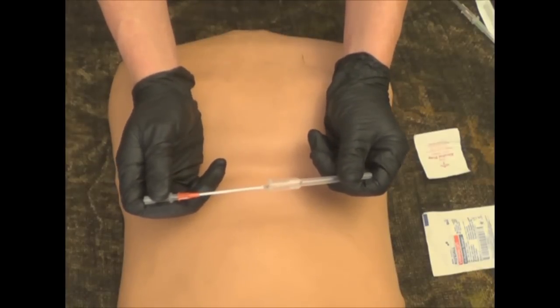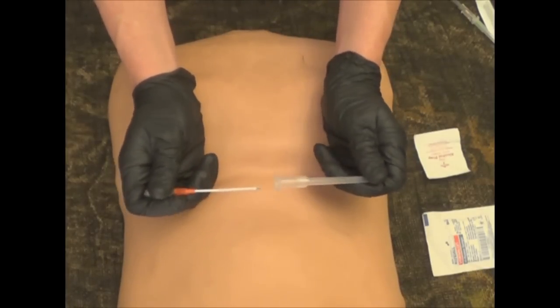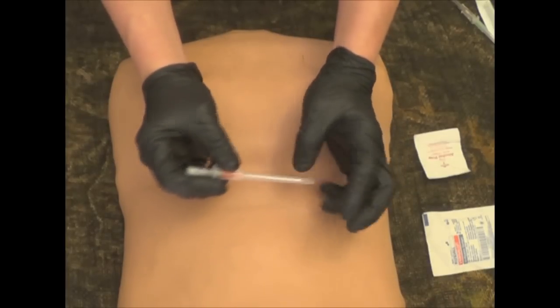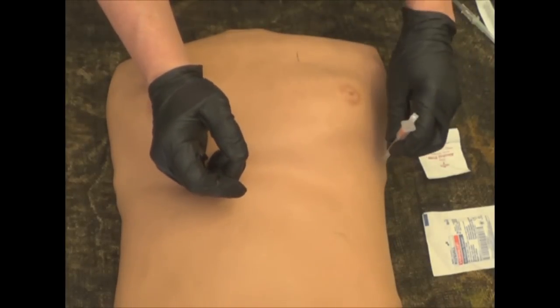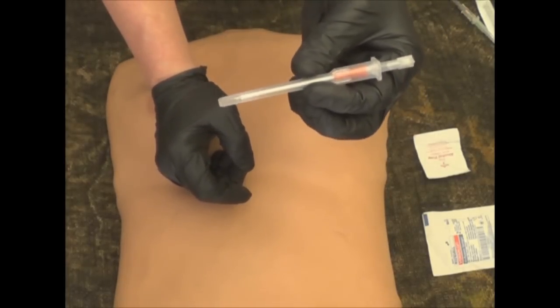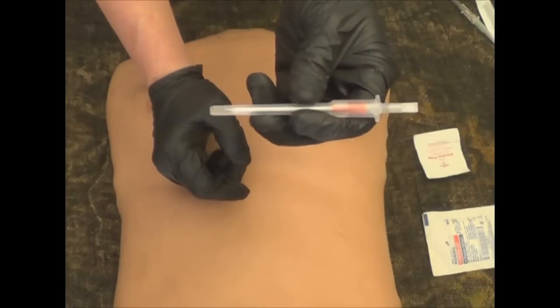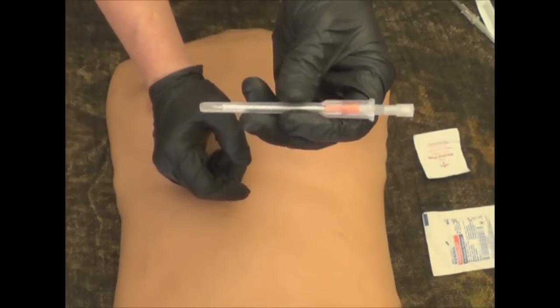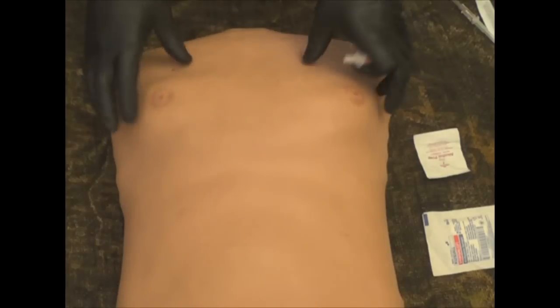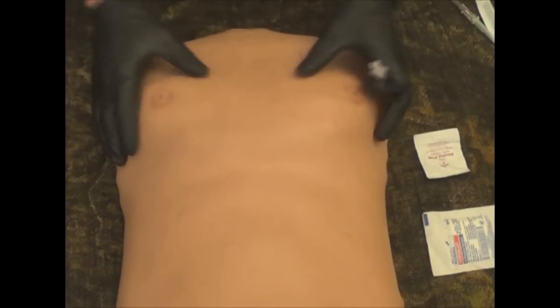Typically what we use is a 14 gauge needle. Honestly, the longer the better. This one here is two and three quarters inches, but if you can get three-inch needles — the longer the needle you can get, the better — because you're going to have to reach through the pleural space, and the longer the needle, the better chance you have of actually getting to the area that you need to. They also make some 10 gauge needles which are even wider, but typically what you're seeing is 14 gauge needles. I'm going to use a slightly smaller needle on this mannequin.